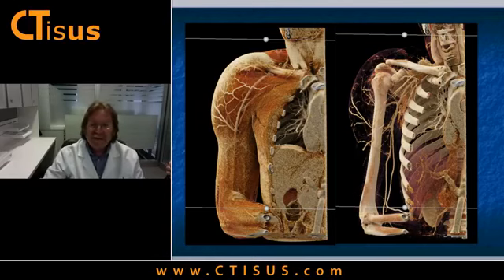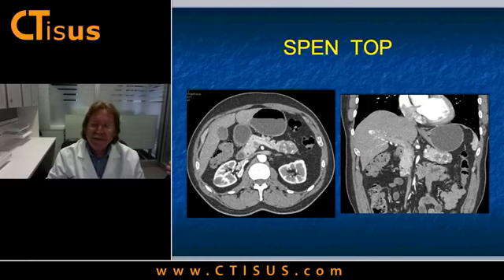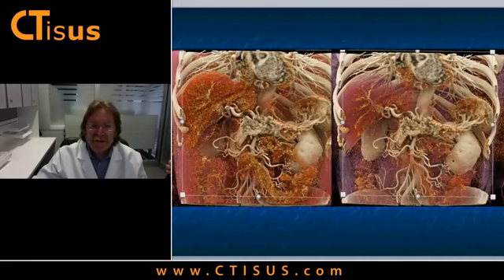Another case, this is a patient with a pancreatic mass, solid pseudopapillary epithelial neoplasm, a cystic and solid lesion in the tail of the pancreas with calcification, nicely shown on the axial and coronal views. There's an incidental hemangioma within the liver seen. So let's look at this with cinematic. Look how nicely you see the lesion. Look at the head and body of the pancreas and the texture, and then you see the textural change in the tail of the pancreas, which is the patient's lesion.